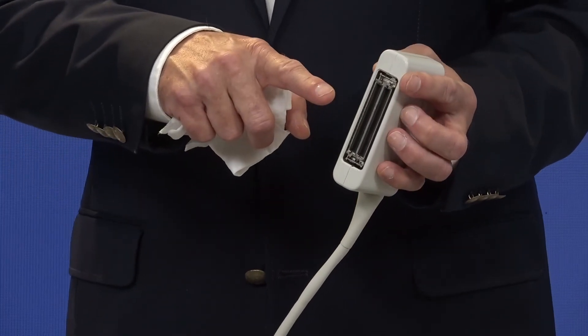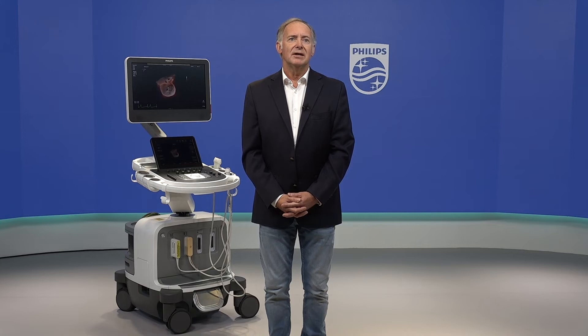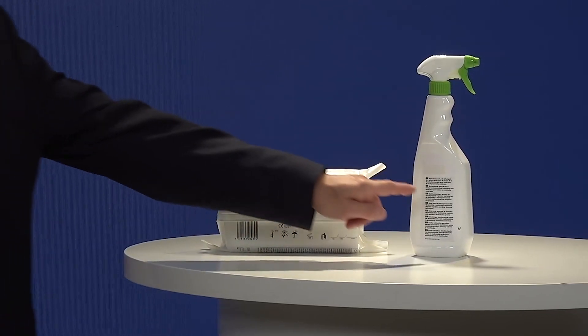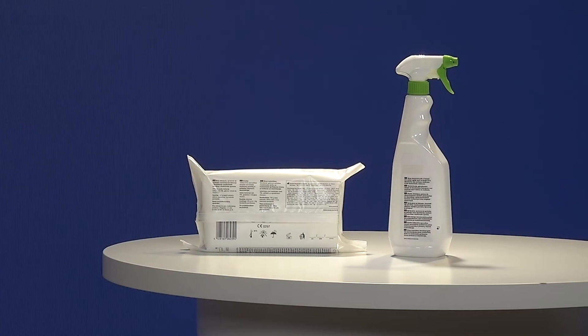Do not allow any type of fluid to enter through the electrical pins of the connector since this can have serious consequences for the functionality of the transducer. When using a wipe or spray disinfectant for the transducer, the cable and connector, always read the disinfectant label instructions for temperature, wipe durations and duration of disinfectant contact. Philips advises a disinfecting procedure of the transducer to ensure a high degree of protection against infectious disease transmission.